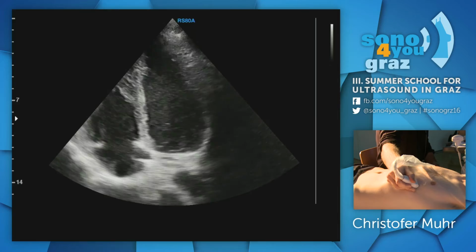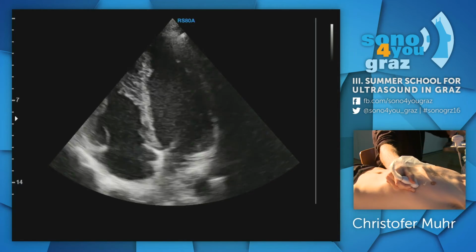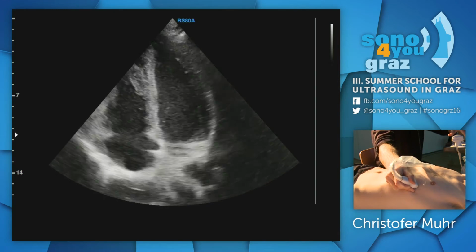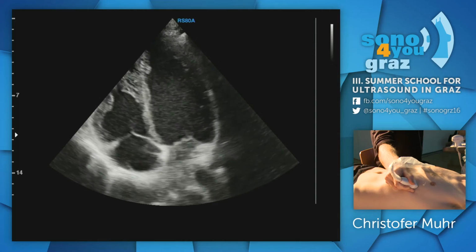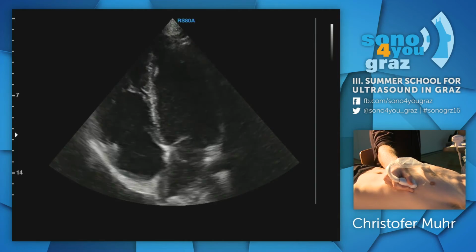And we're talking about that, and now I think you feel how pleasant the Swedish rib massage is, right? So I'm standing on the rib, really looking above it, because then I can cut the heart in the right angle, okay?